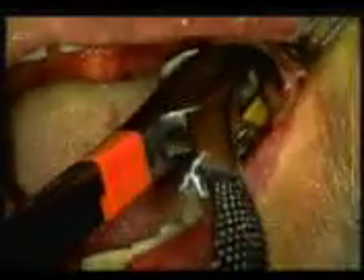Sometimes I'll use the 23 even if the root isn't a bifurcated one, but a molar nonetheless. So I'm going to start moving a little bit, doing a little bit of figure eight. You can see the tooth has already popped loose.